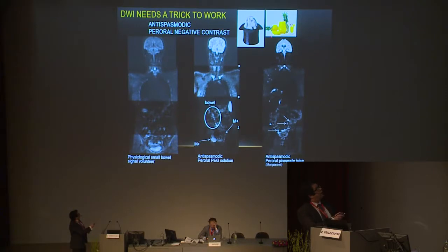The pineapple juice is very tasty, so they like to come to the scan. That's an advantage. Second, it distends the bowel, but third, it contains manganese. And manganese works like iron. An MRI is a magnet. Iron makes your image dark.